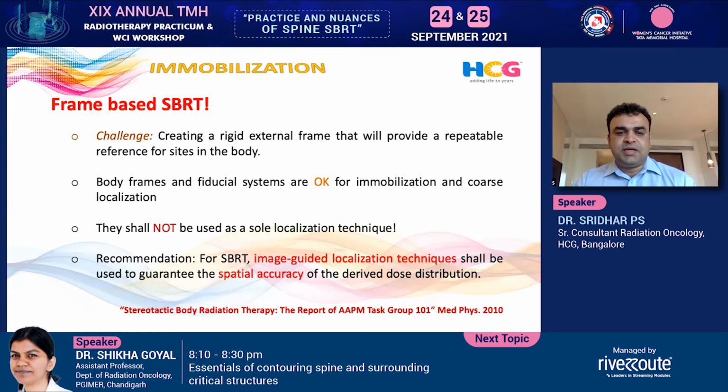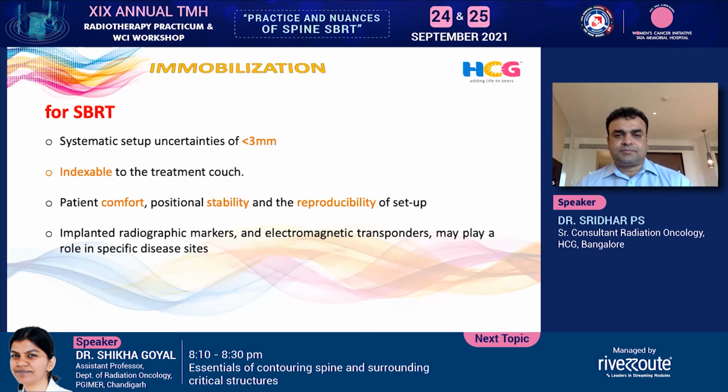Frame-based SBRT: these challenges we have already talked about. We all know about it. Anybody who starts SBRT, I am always not a very strong promoter of fixed frame-based SBRT.